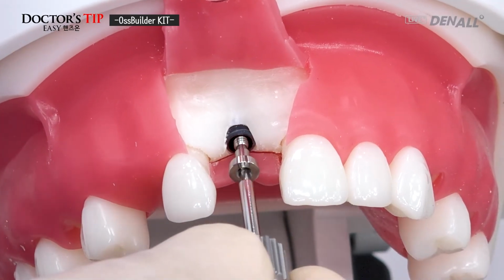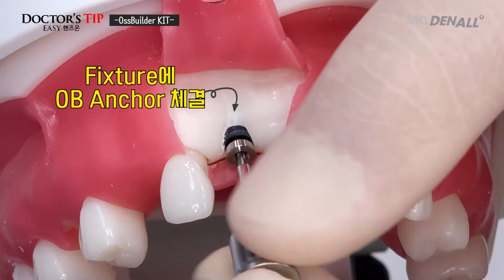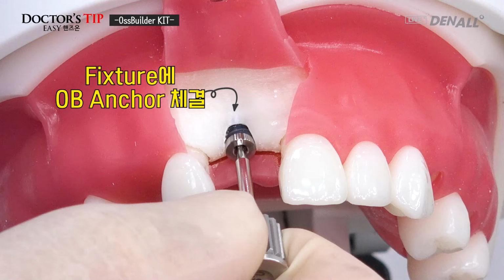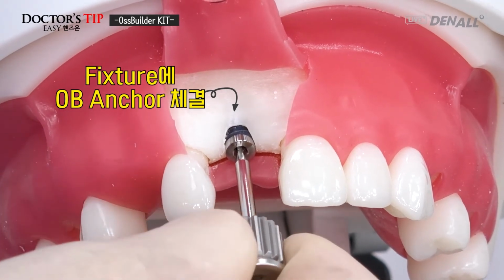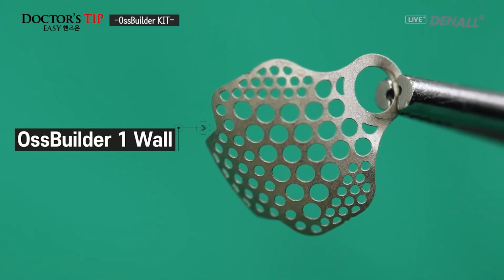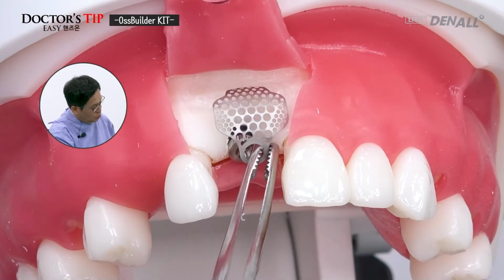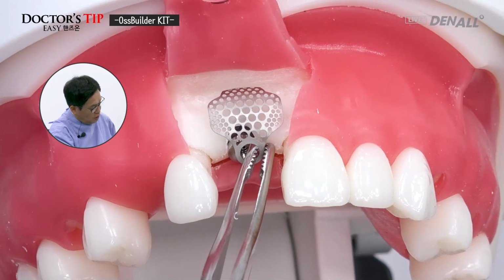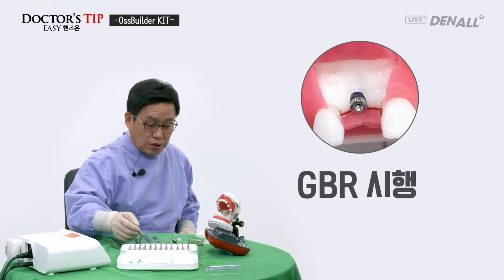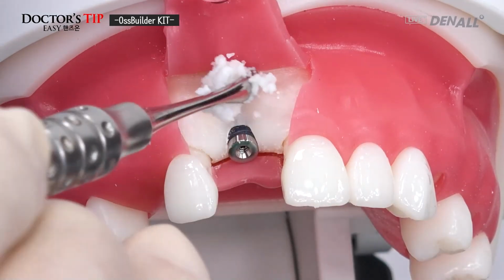Using the OB anchor on the fixture, I'm connecting it. OB anchor height is 1.5 millimeter. OssBuilder is one hole. As you can see, on the area to be connected, I'm going to put it on. Check it. I'm going to do GBR first. Graft material.